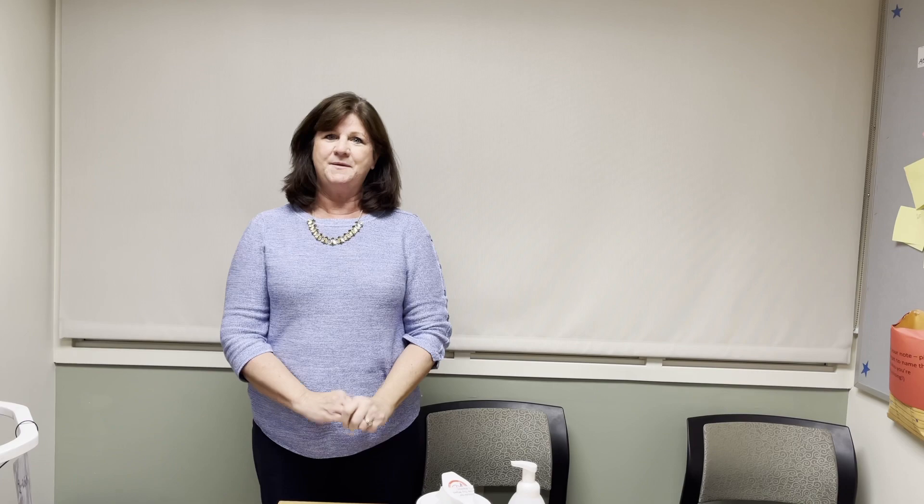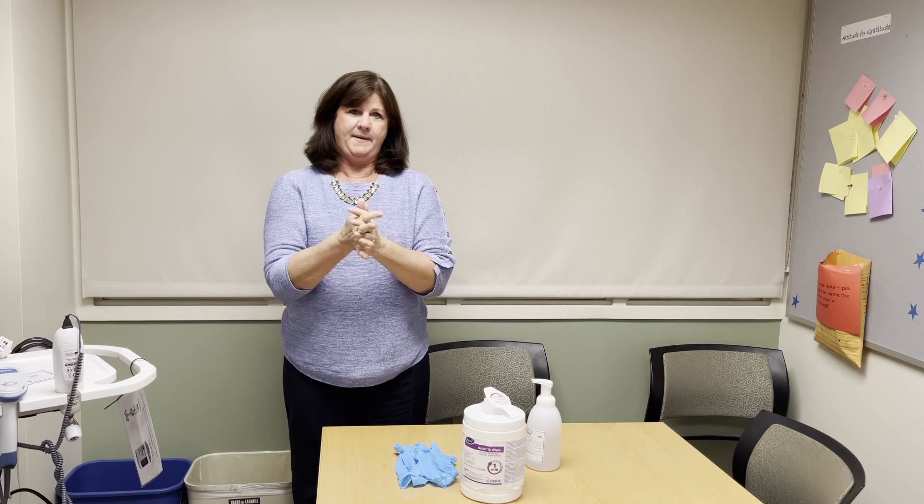So now let me demonstrate. First, you want to wipe the probe off with an alcohol prep pad. So let me just get my gloves on.